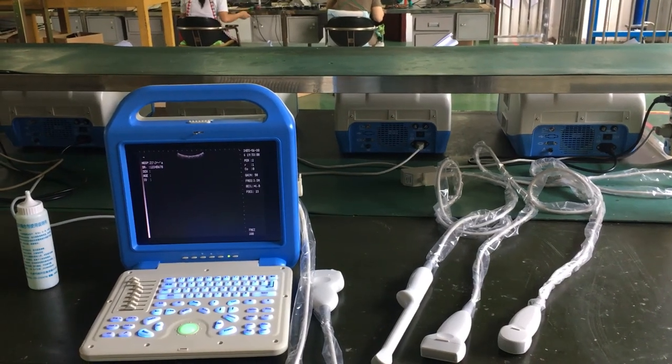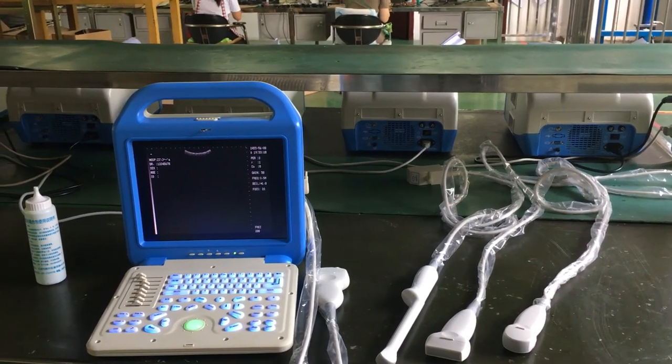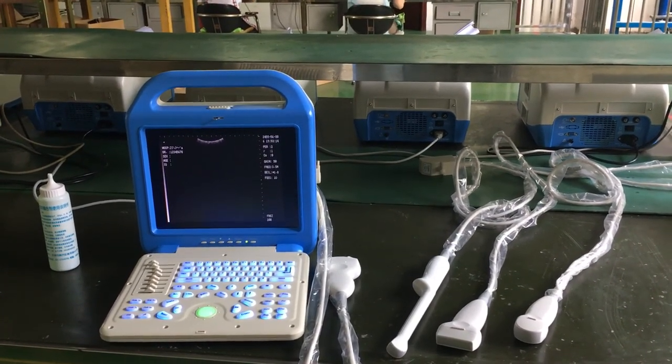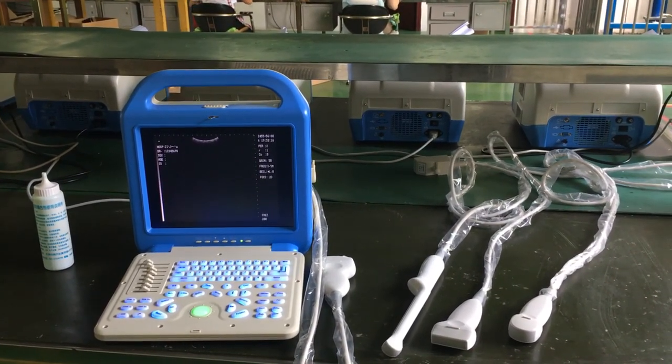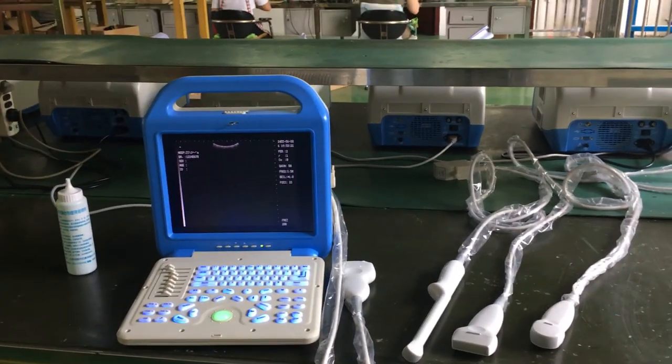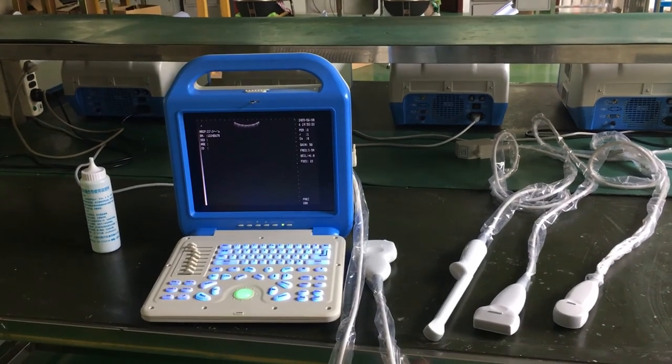Now we introduce our laptop ultrasound scanner. This machine has two different software — it can be used for human or animal use. When we choose different software, its function is different.